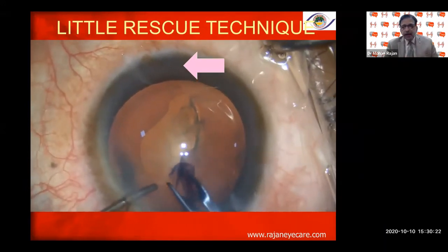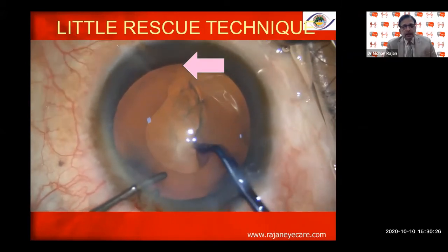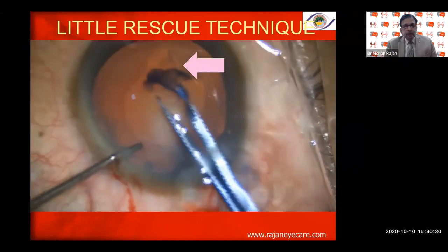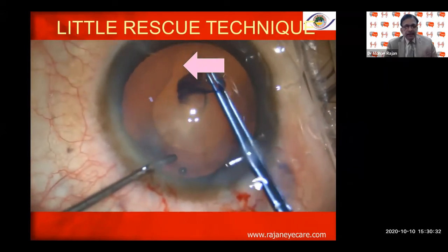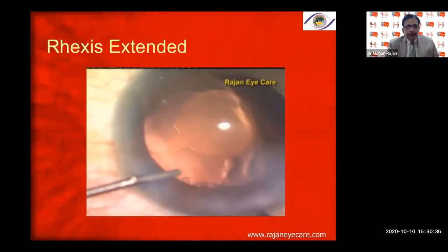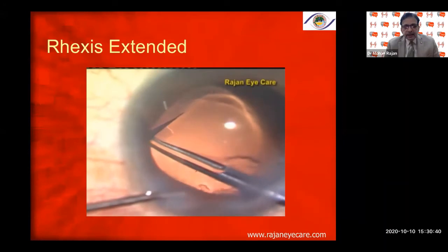This is called the Brian Little rescue technique, described by Brian Little from the UK. It is one of the very good techniques to prevent the rhexis from going into the periphery, especially when it goes beyond the 7-millimeter zonular area.